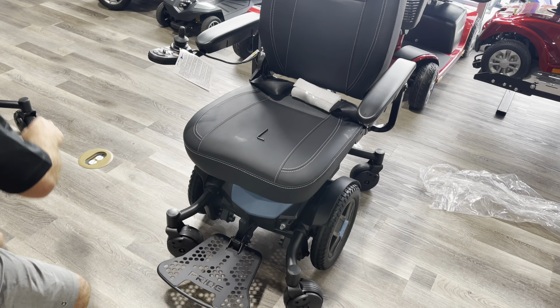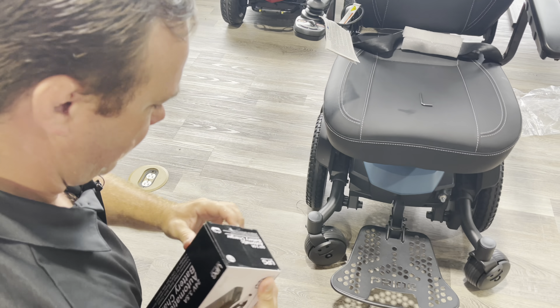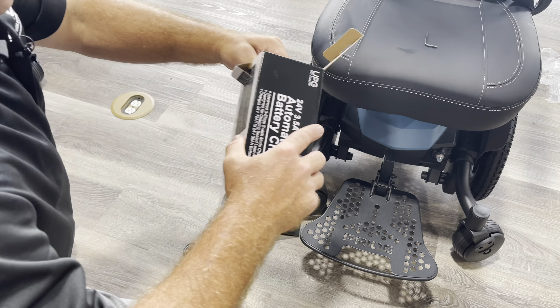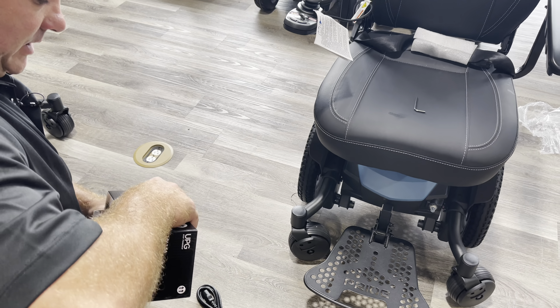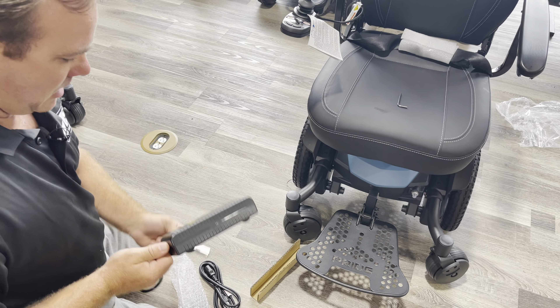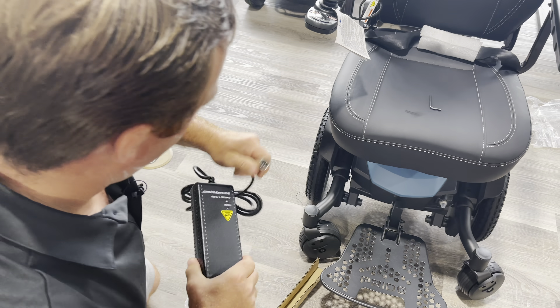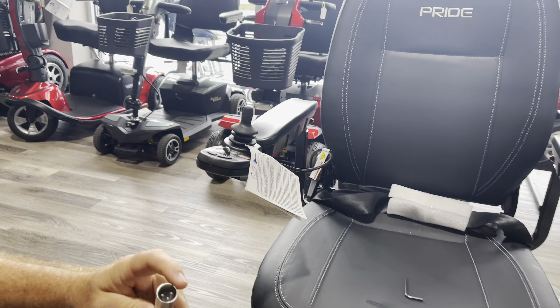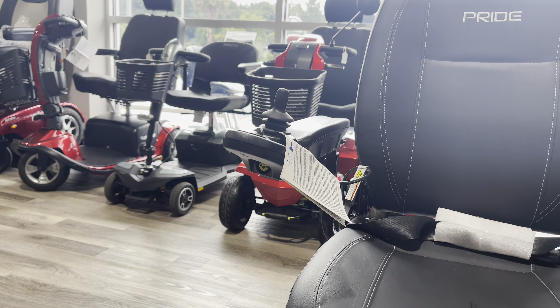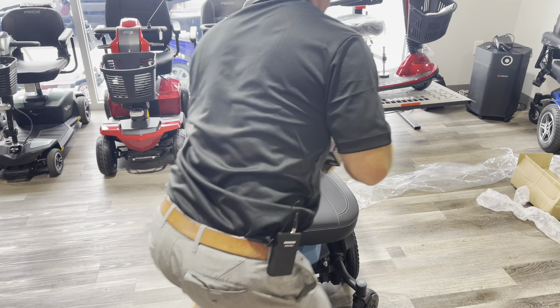Circuit breaker - that one's done. Here's a charger - so you unbox this charger. This one has a different charger than the other one because they're different batteries. You would plug this in like so, make sure it's snug. Plug this right into here - there's a three-prong. Plug it right in and then plug it into the wall. Let it charge up overnight and you're ready to roll the next day.